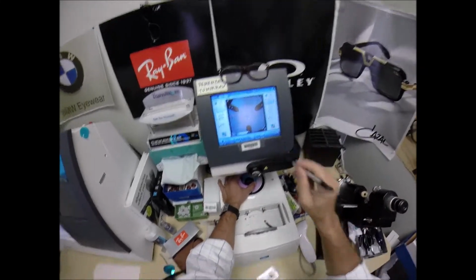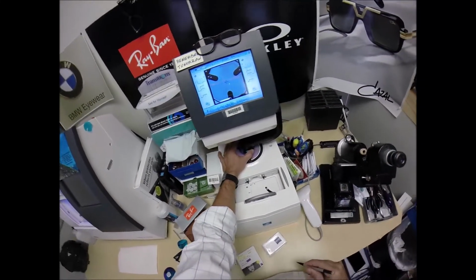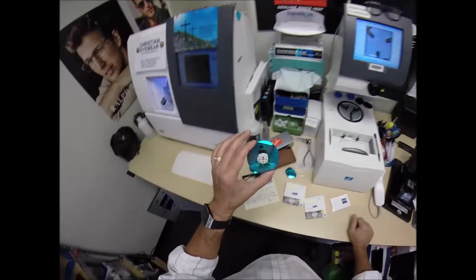So hit that button. The arm's going to come down, place the block onto the left lens.